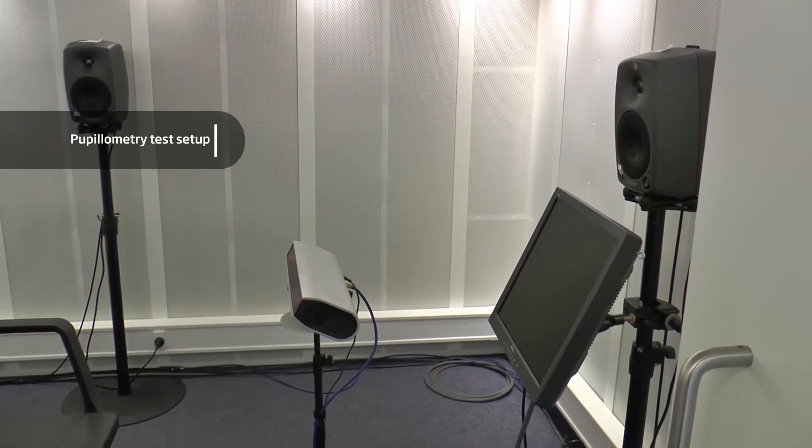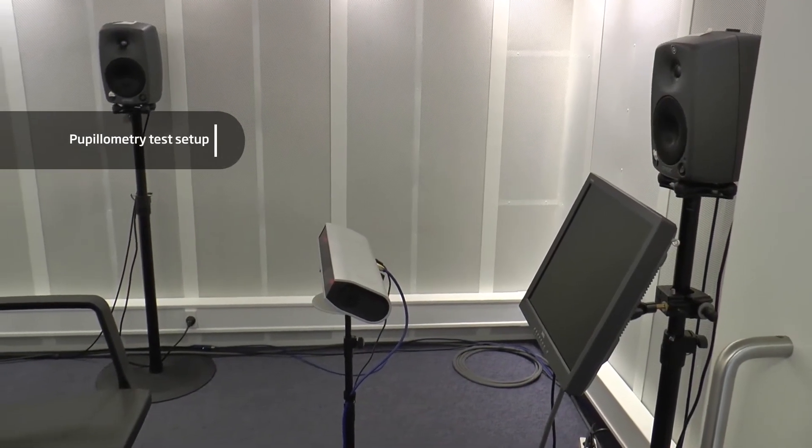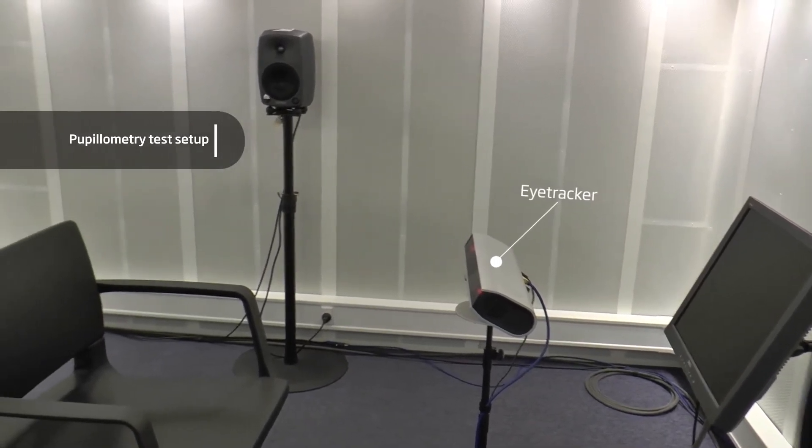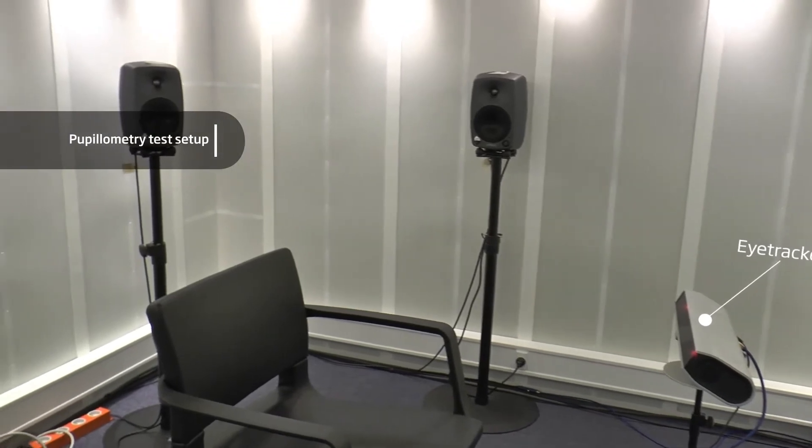The pupil size and reactivity can be measured using pupilometry. In this test, the person is placed in front of an eye tracker which continuously monitors the size of the pupils and the pupil dilation.